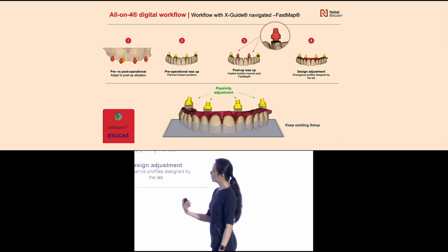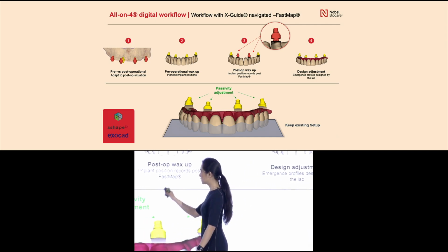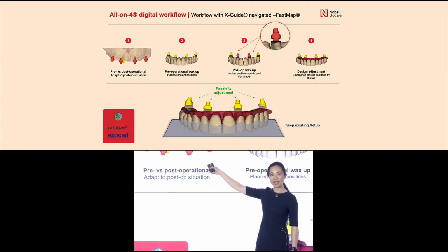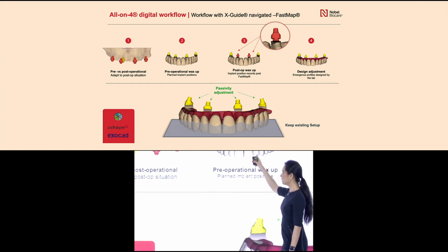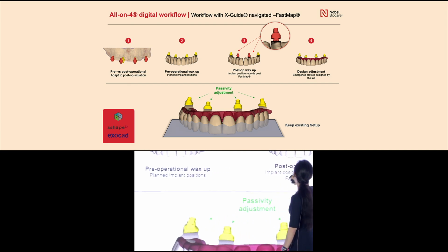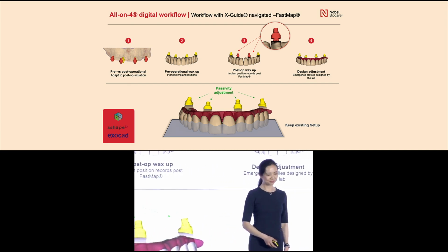And when you're looking at the digital workflow in terms of how it adjusts data, they'll actually account for the initial scan and accept that probably most of them are accurate, and just change up the data so that for the ones that don't match 100%, they'll kind of finagle it in and move forward from there.